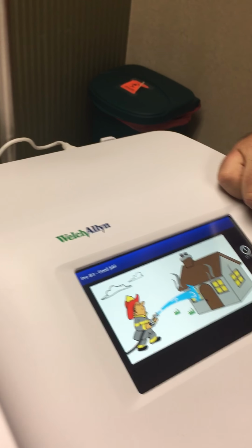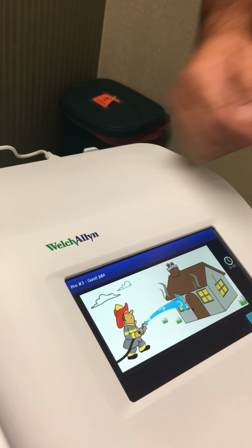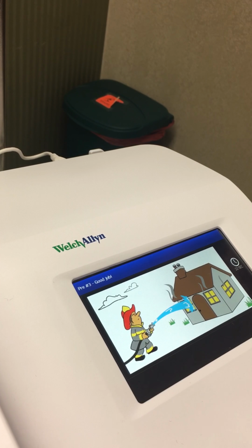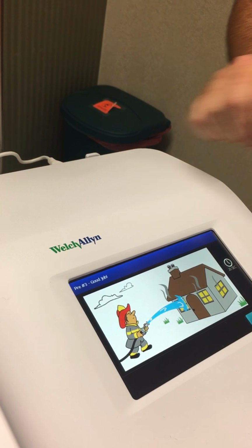Is that like a 5-second count? This one, yeah. What happens is this machine actually senses the airflow over time. So once it comes to a plateau, then it kicks off. Oh, okay.